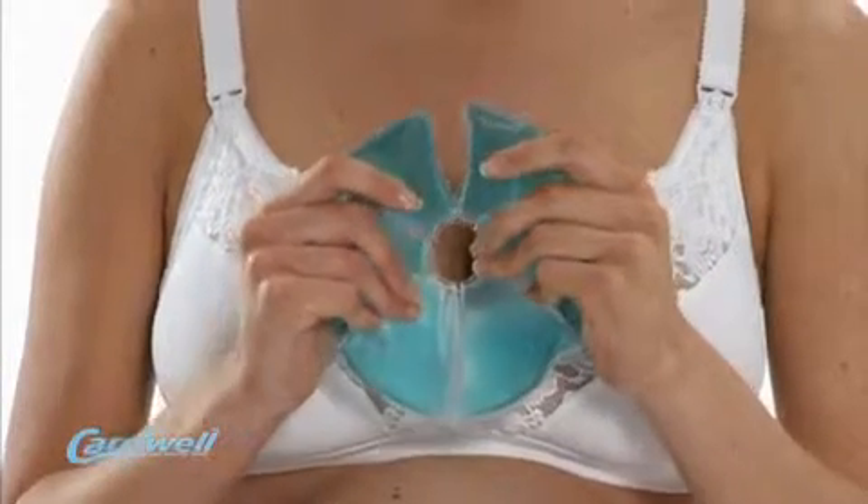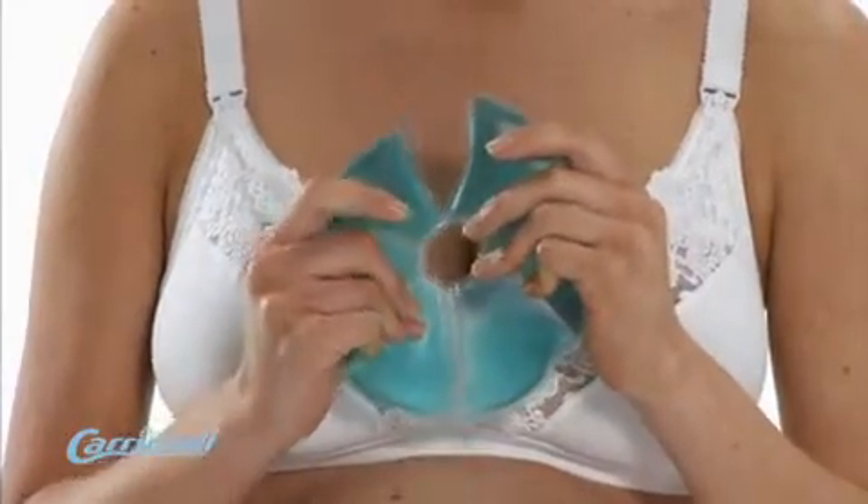The Breastsoother is sold in packs of two and clear instructions for use are enclosed in the pack.